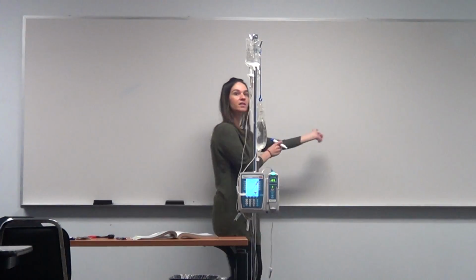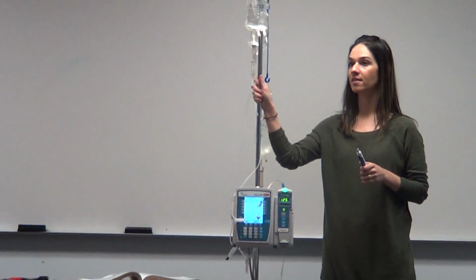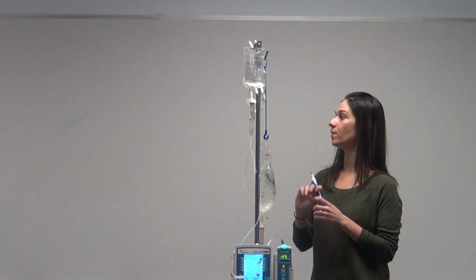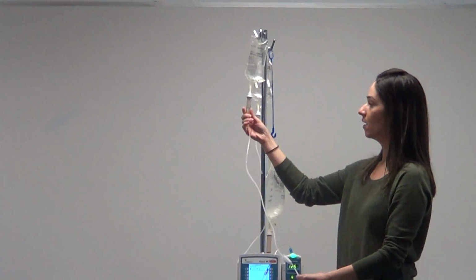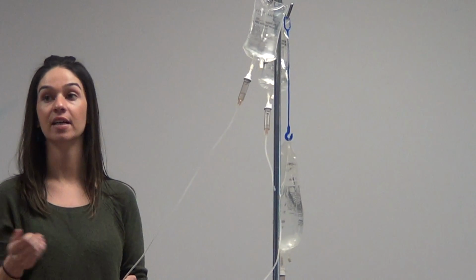So what y'all need to understand, when we talk about flow rates, that means what? That means how fast the infusion is going into the client, correct? Well, we have two types of flow rates. So do y'all see this one? This is called by gravity. So literally, we are not using any pump when we're doing a flow by gravity.